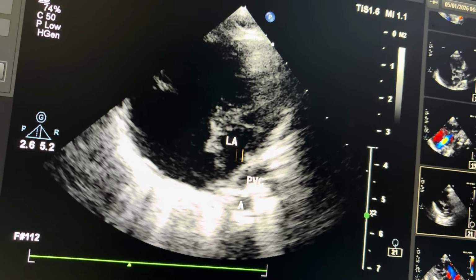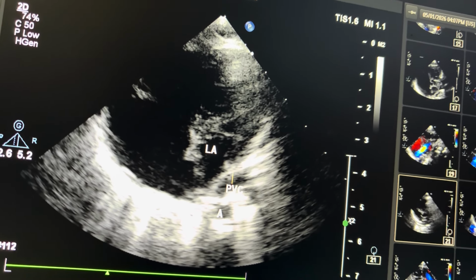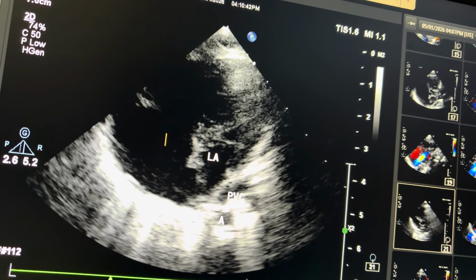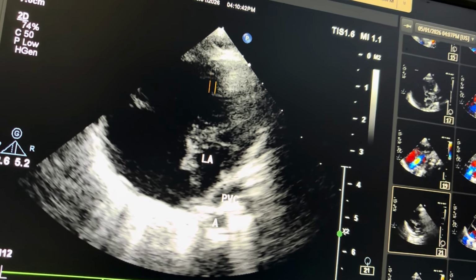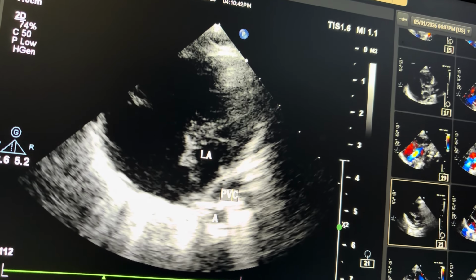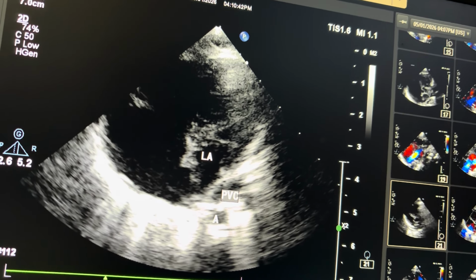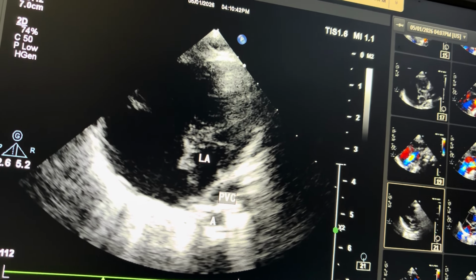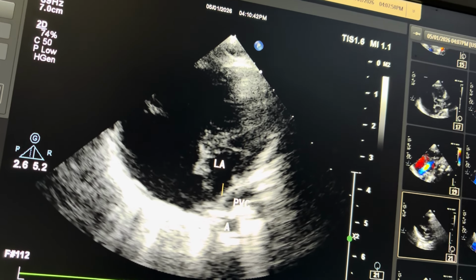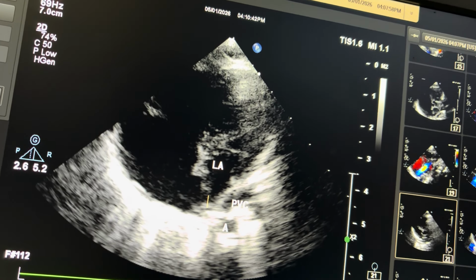Whenever you get this kind of apical four chamber view, you will not get the right pulmonary artery branch also. But if any confusion arises, it arises with the right pulmonary artery branch. The right pulmonary artery has more velocity because more blood is going through the right pulmonary artery, but the pulmonary venous confluence has less blood, so there will be very low velocity. So velocity wise, if it is the pulmonary venous confluence, then velocity will be very low. Color wise you can find out. Scenario wise, the right atrium is very much dilated, the left ventricle is D-shaped in nature, and the ASD has flow from right to left, that is blue flow.